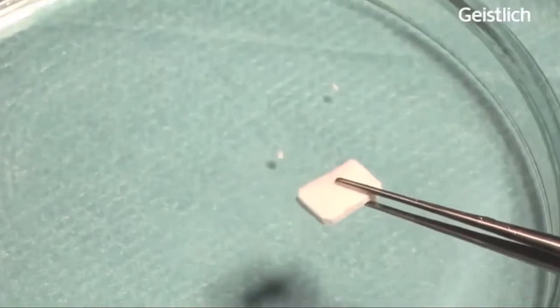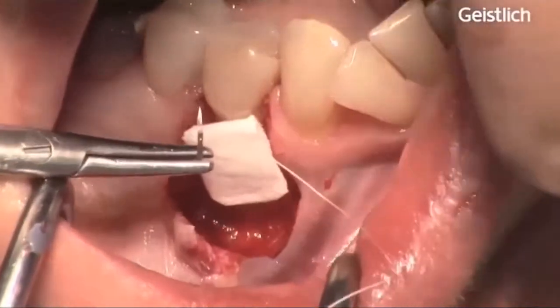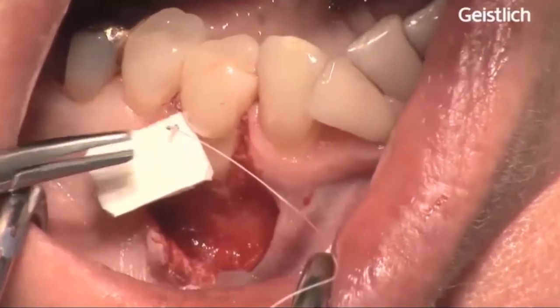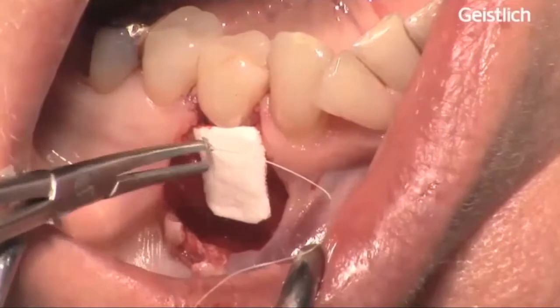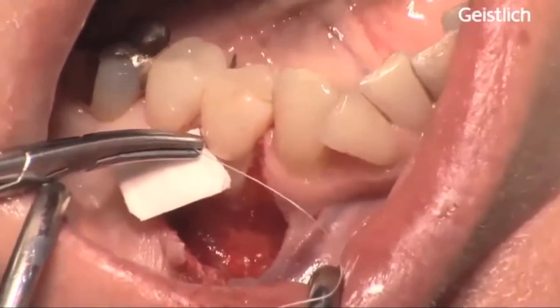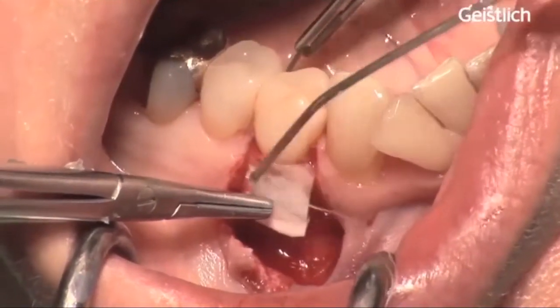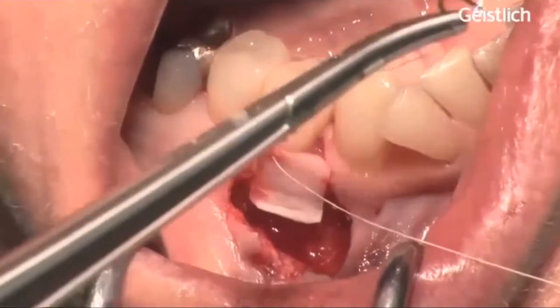The sharp edges are removed and the matrix is fixed to the root surface with resolvable 6-0 sling sutures. Complete penetration of the matrix by blood and exudates allows perfect adhesion of the device. Formation of a hematoma beneath the mucograft must be avoided.